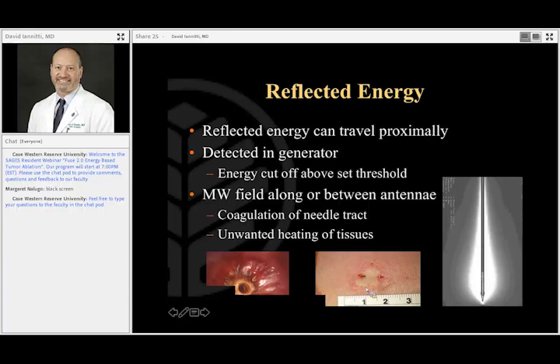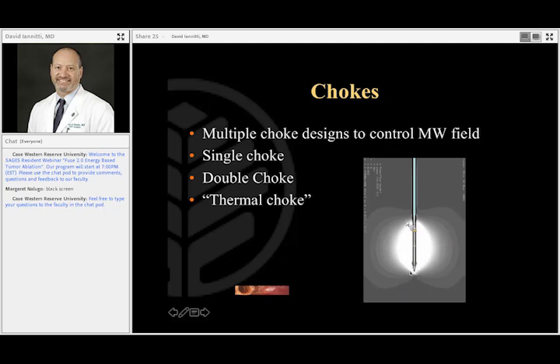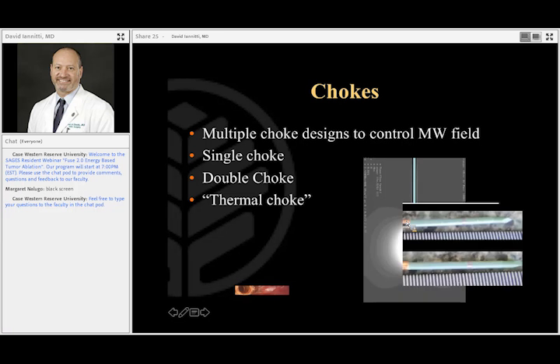So to try to control that energy and try to decrease reflected energy coming back up, you can't control the permittivity, obviously. Then you can choke your antennas. By choking antennas, you give more outer conductor exposed back up on the cable to try to keep that wave concentrated at the radiating tip, so you don't have wave carrying back up the cable itself, causing damage that you might not want. There's all different types of chokes and reflectors that you can use to try to control that energy. And again, this is just some of our design stuff that we do.